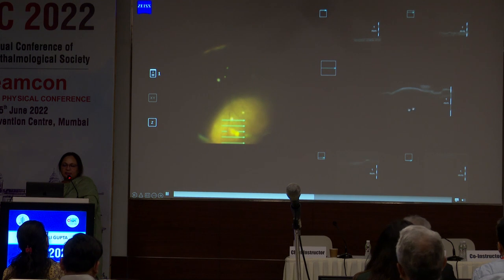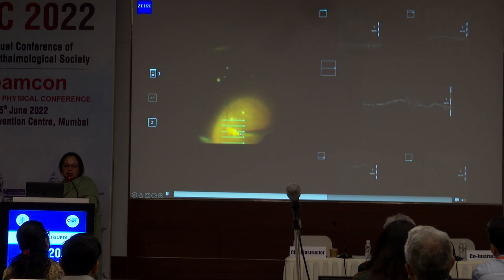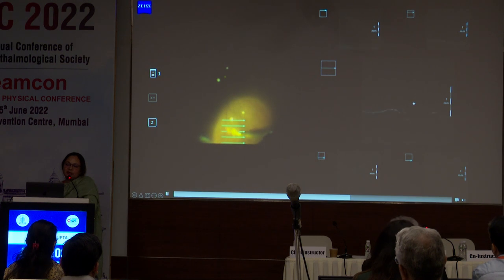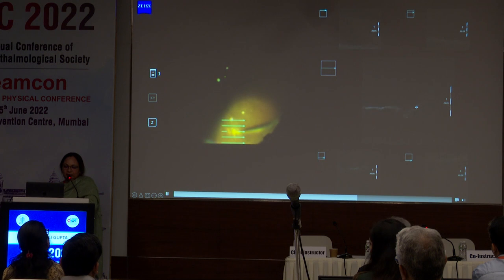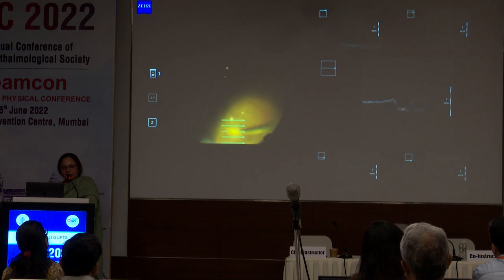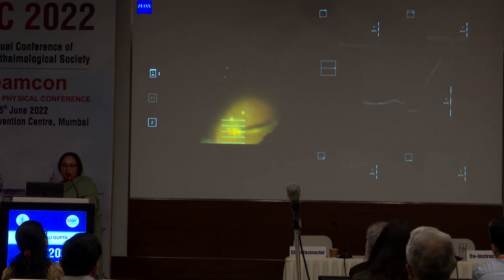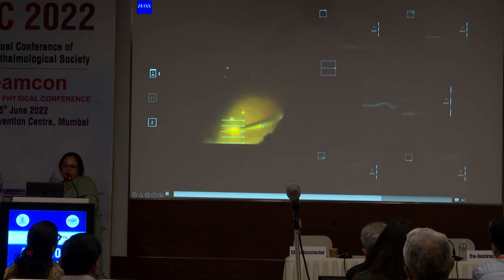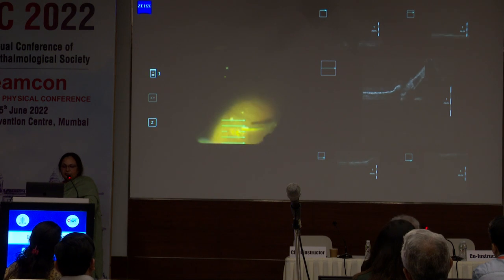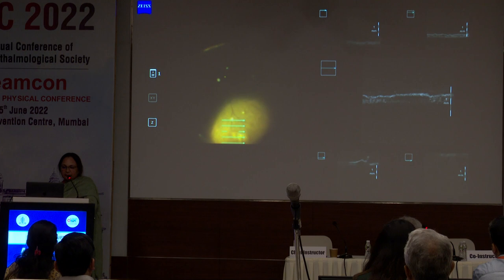You let your scan pass through this. You see what is the exact lesion, a small diathermy, and the soft tip extrusion which goes through this into the subretinal space. You make sure it's very long, and you can actually see on OCT the tip going in the subretinal space here. You hit the cells, and you can see the cells floating into this extrusion, the soft tip extrusion.